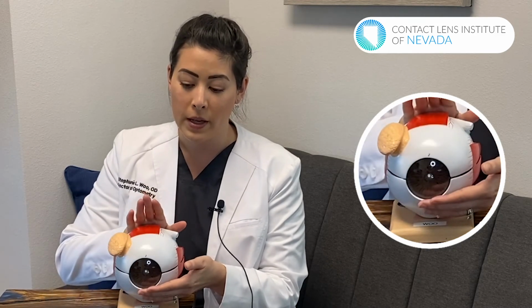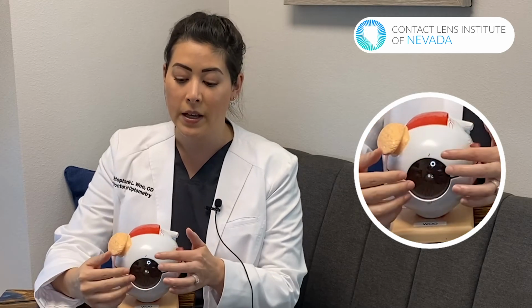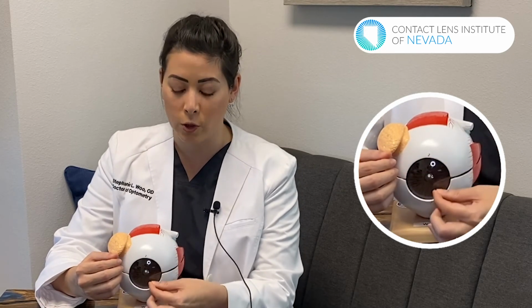After the laser has ablated that tissue and changed the shape, which can take between 5 seconds to 1 minute depending on your prescription, the surgeon will place the flap back on. Imagine it's peeled up and then it's put back on. Then he or she will smooth out the surface of that flap to make sure that it is adhered to the cornea again. After this, sometimes doctors will put a bandage contact lens on, or they'll leave everything alone and just put some artificial tears on. Either way, the eye is fully protected and the surgeon will definitely take a look before they send you home.